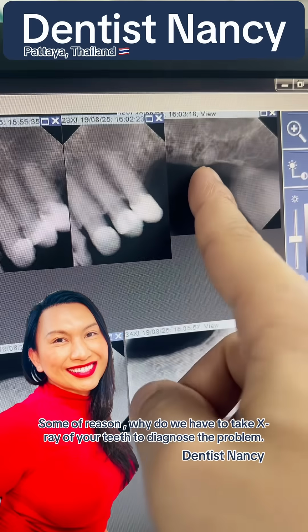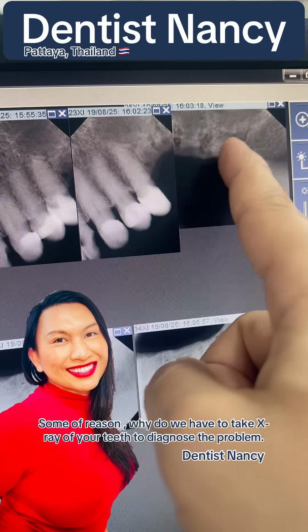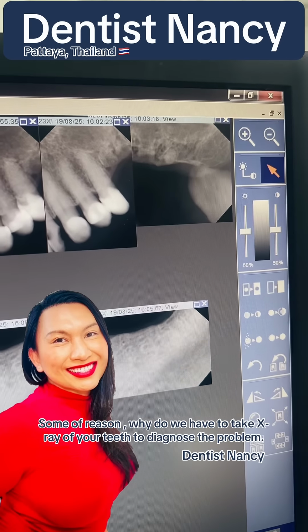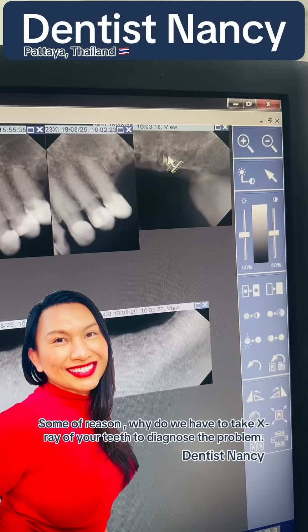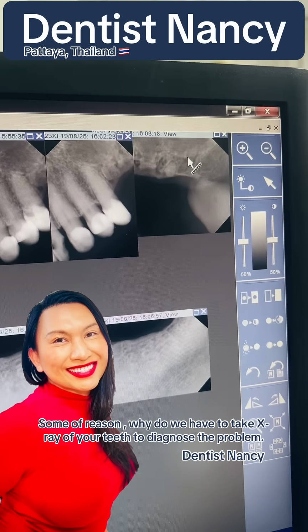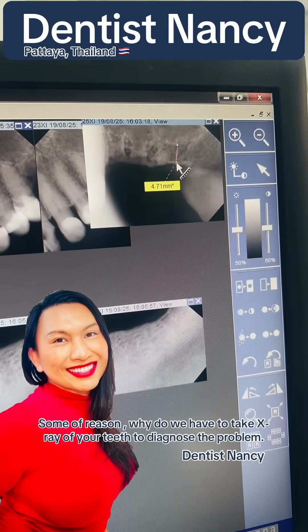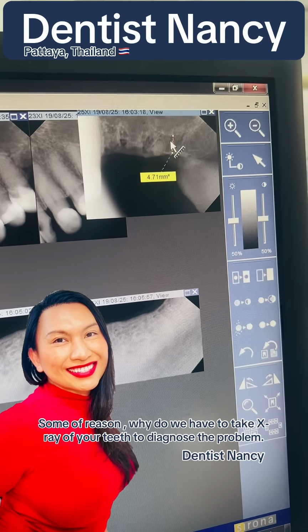See, we also check if there is anything in your bone in this area. If the patient wants to get a dental implant done, we have to check too, like if there is anything in the bone. We can also check how thick the bone is. For example, we want to put a dental implant in here. We want to know how thick the bone is. We can also measure the height of the bone.